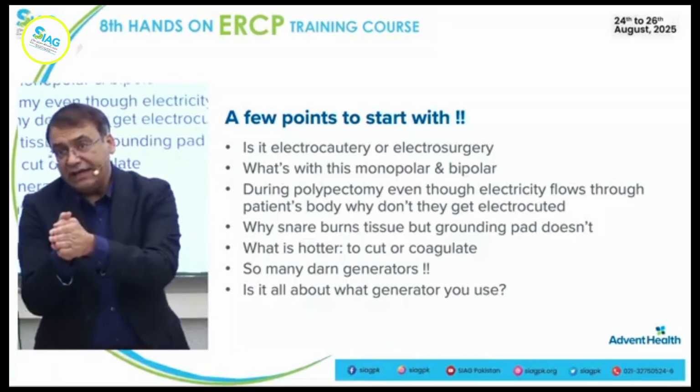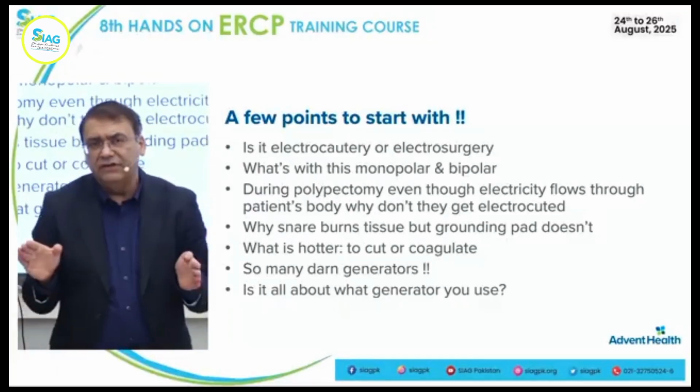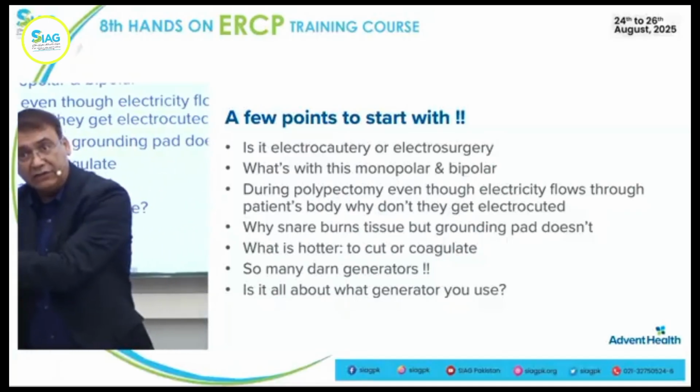Olympus, on the other hand, has this blended 1, 2. All depends on how much the cutting is, how much the coag is.